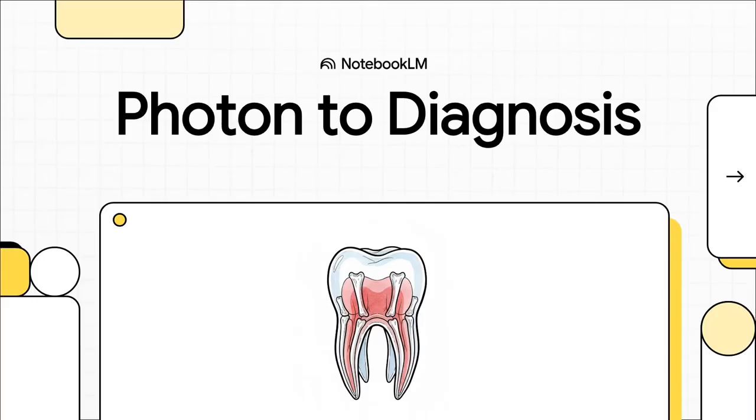You know the drill. You're sitting in the dentist's chair, they put that heavy apron on your lap, and you have to bite down on that awkward piece of plastic. But have you ever stopped to think about what's actually happening in that split second? Well, today we're going to pull back the curtain on the incredible journey of a dental X-ray, all the way from a single photon to a final diagnosis.